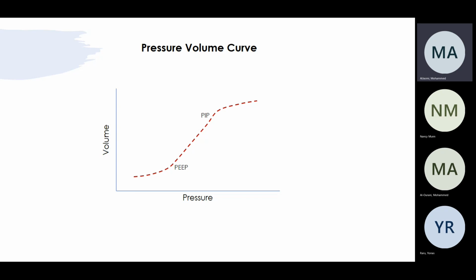So then I might be having what we call low volume lung injury. But if I increase the peak, or increase the PEEP, we'll have a high volume lung injury or high PEEP lung injury. That's why we need to keep my patient in the protective area, where the patient will have enough PEEP, enough pressure.